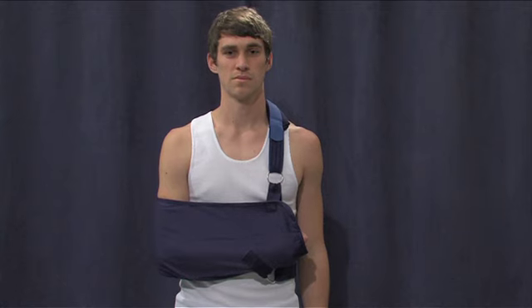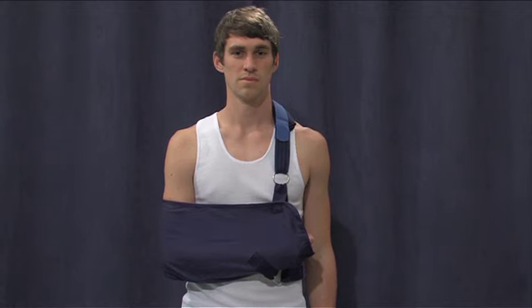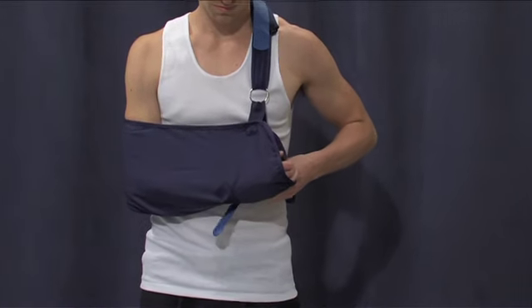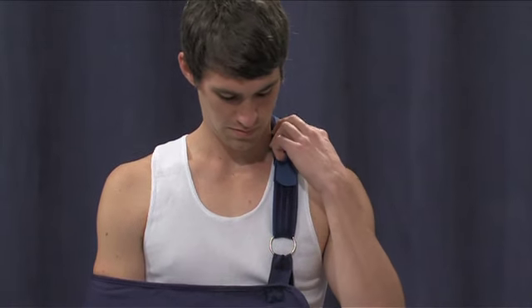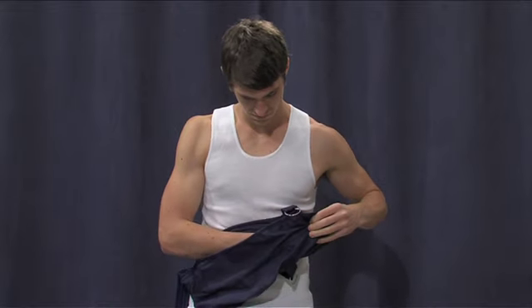Generally speaking, the sling will be on your arm when you wake up from your operation, so we will start today by showing you how to remove the sling, and then show you how to reapply it in a safe manner. Remove the sling by first undoing the waist strap. Next, undo the shoulder strap and then slide the sleeve of the sling off your arm. Keep your arm touching the side of your body while you do this and do not lift your arm up in the air. Later in this video we will show you how to clean your axilla or armpit in a way that does not activate the muscles of the shoulder.